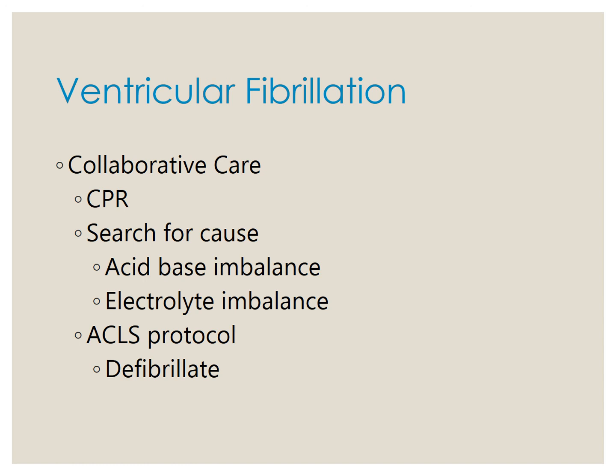So if you are on like a med-surg floor, you would call a code, you would get the monitor and put them on the pads, and then prepare for defibrillation. So when they get up there, they will defibrillate this patient.